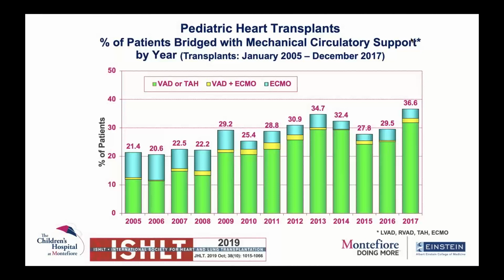Now, compared to the 2005, 6, 7, 8 era, if you look at the current era, 2013, 14, 15, you can appreciate that the number of patients who are getting bridged with VAD to a transplant is increasing.